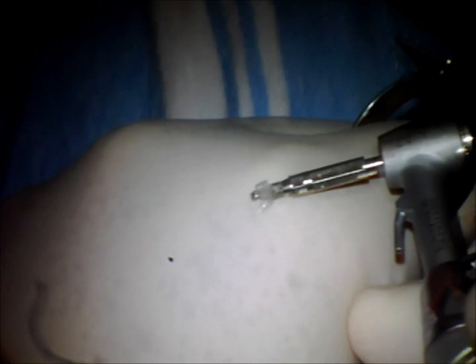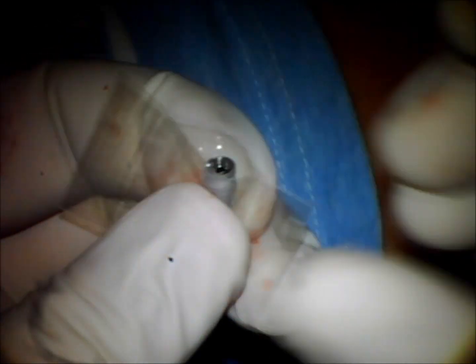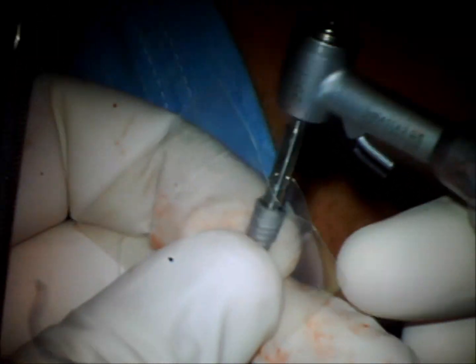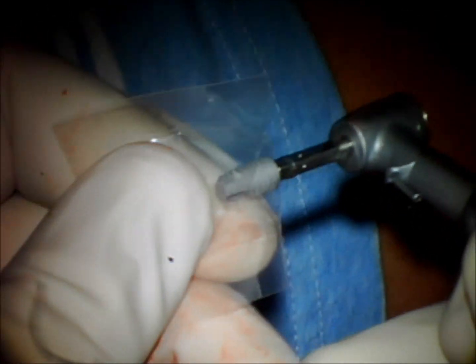So here's our implant. A little something I do — you'll notice a little bit of stuff on the end here. This may or may not be necessary, but I usually coat the end with Neosporin. If you've ever had the experience on a lower implant of the implant falling off in the mouth, or on the floor on the way to the mouth, it can ruin your day and be a costly mistake. This actually creates a little surface tension so you don't have to worry about it.